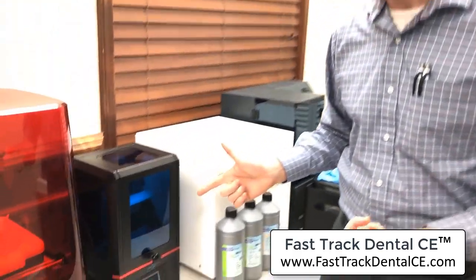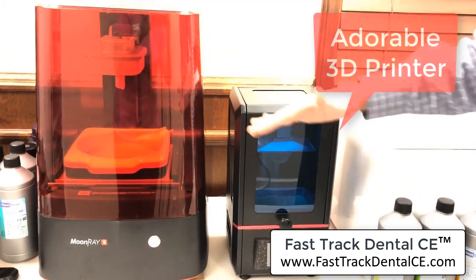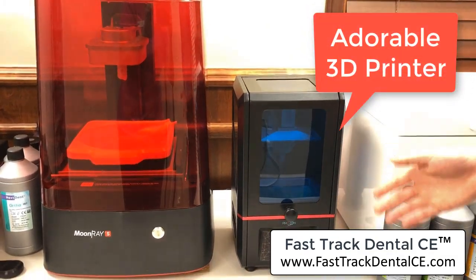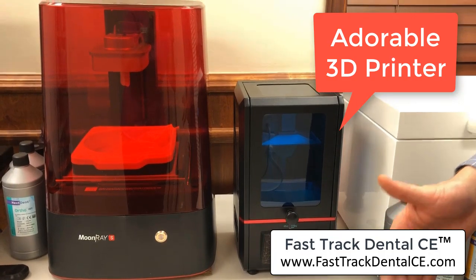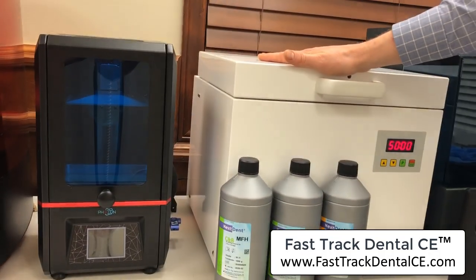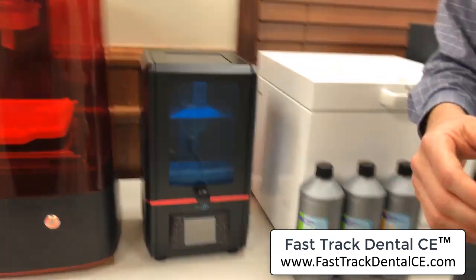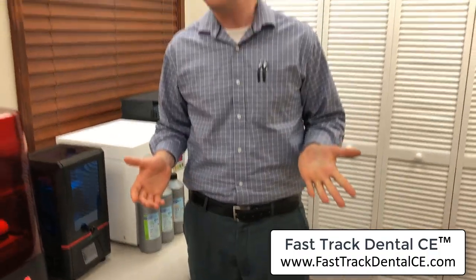I got this cute little 3D printer — check it out. I put it right next to the Moonrays so you can see the size of it. A lot of times you can't really tell the size from pictures online, but this thing is petite — super petite. You can see it right next to my light-curing box from NextDent; it is so small.